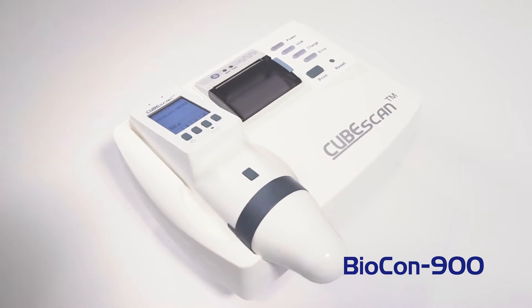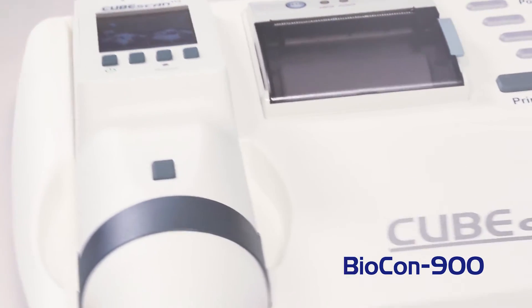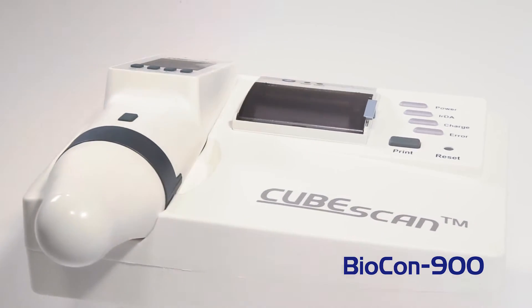Biocon 900 is the latest version of the CubeScan series and is much more convenient and useful than existing products. Let's learn how to use the CubeScan Biocon 900.